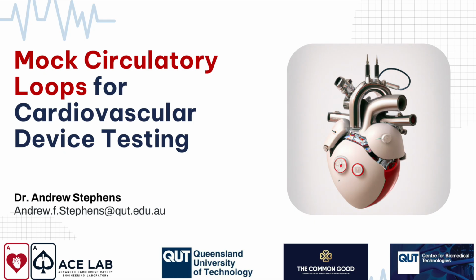In some rare instances, you may also want to pulse the atria as well in simulating exercise. So here's this middle one here, you can see has a motor, which is turning rotary motion into linear motion to create displacement in the ventricle.